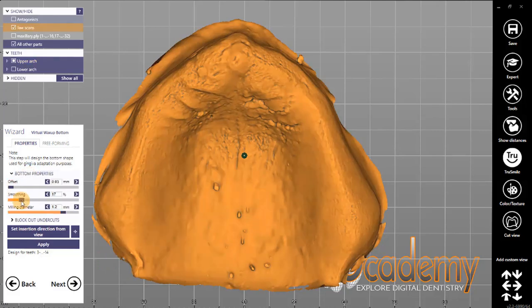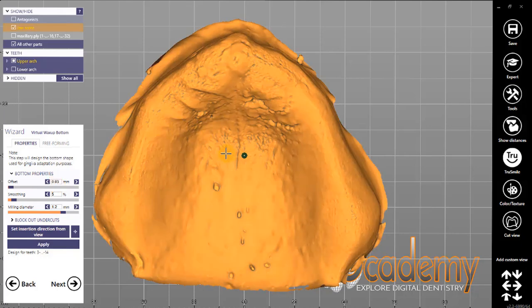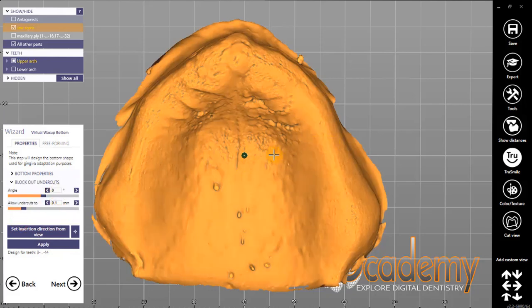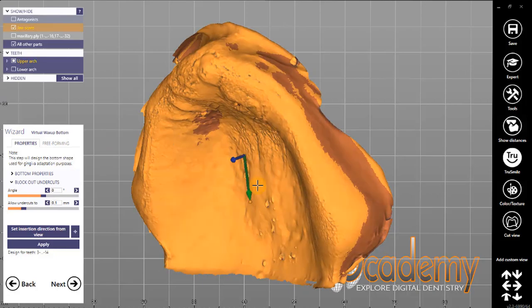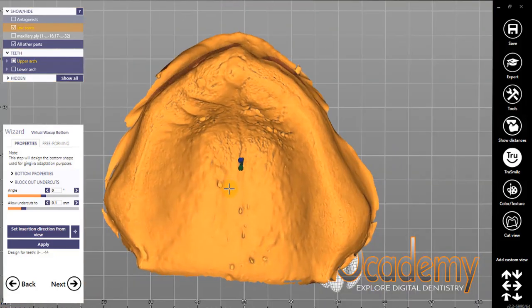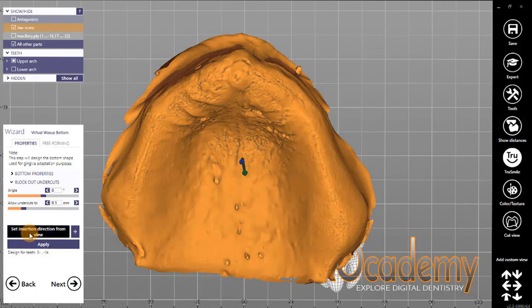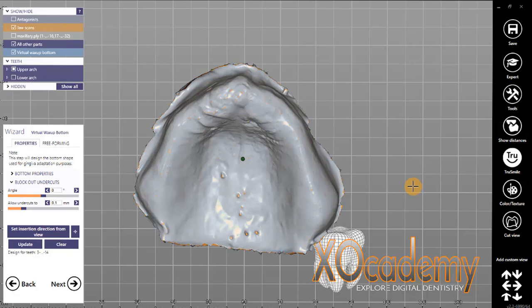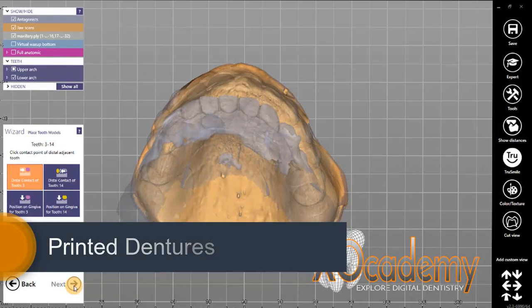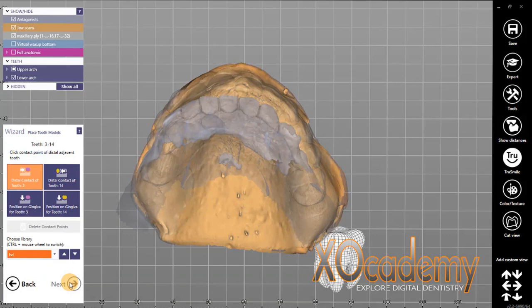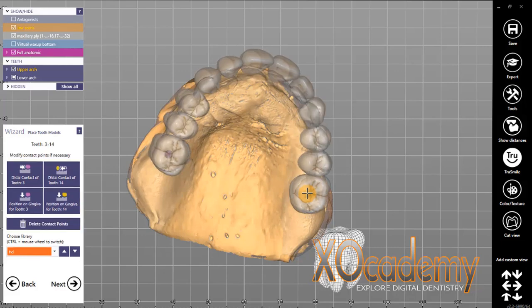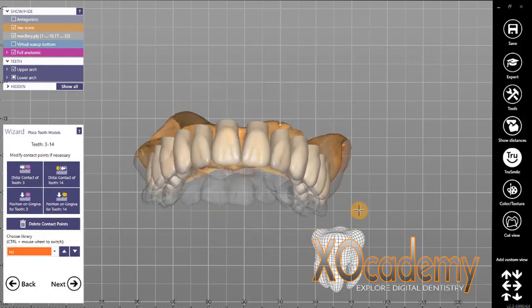Now we move forward in the step-by-step wizard and we're designing the inner surface of the denture. You have lots of options — you could make an offset distance if you wanted to make custom trays with a very specific relief amount for your wash material. You can do that in ExoCAD. For this case, since we're going to be making a denture, we don't want that offset too great. So we make that inner surface and then we're able to place our denture teeth.